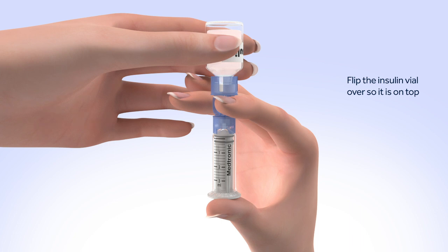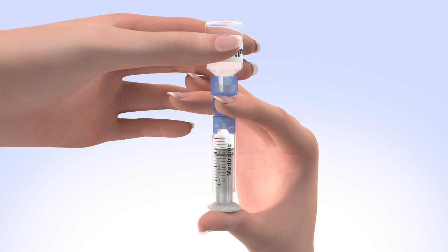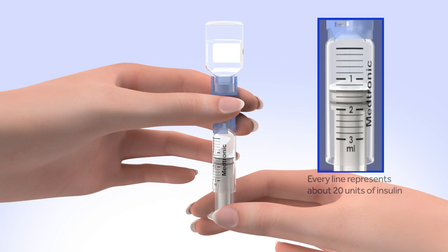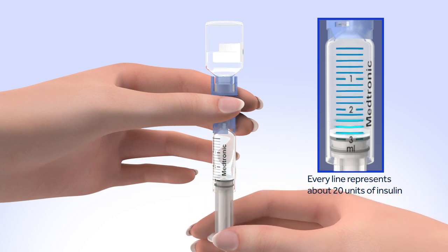Make sure you are holding the vial with your other hand. Slowly release your thumb pressure from the plunger rod and the reservoir will start filling with insulin. When the reservoir stops filling, pull down on the plunger until the top black o-ring lines up with the desired amount.